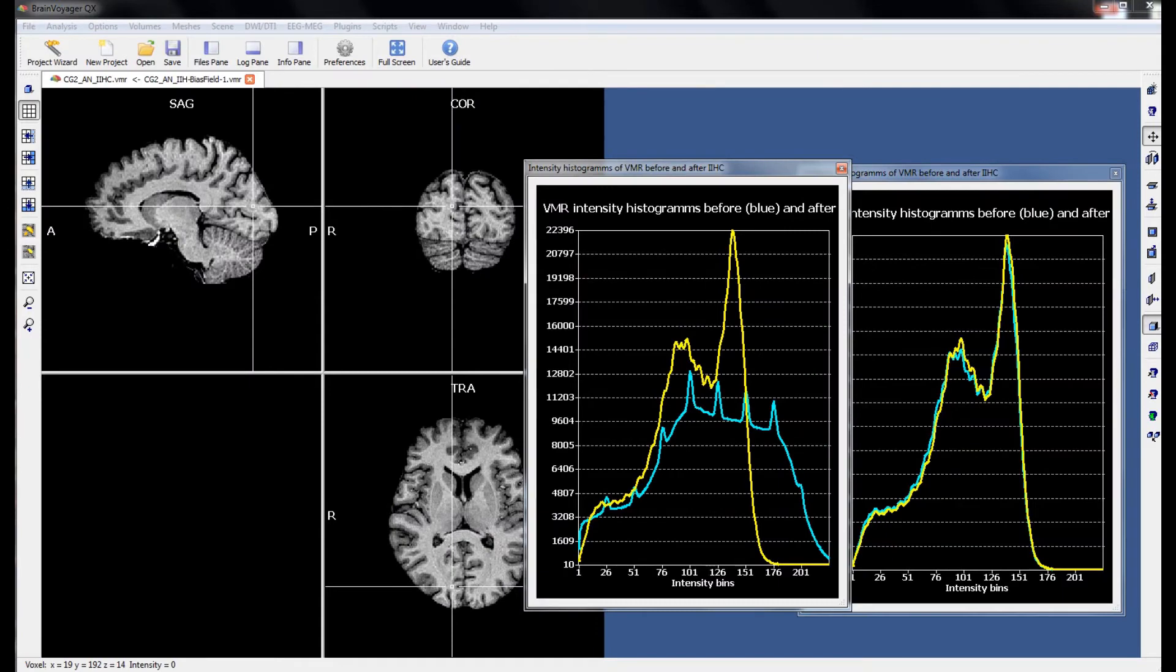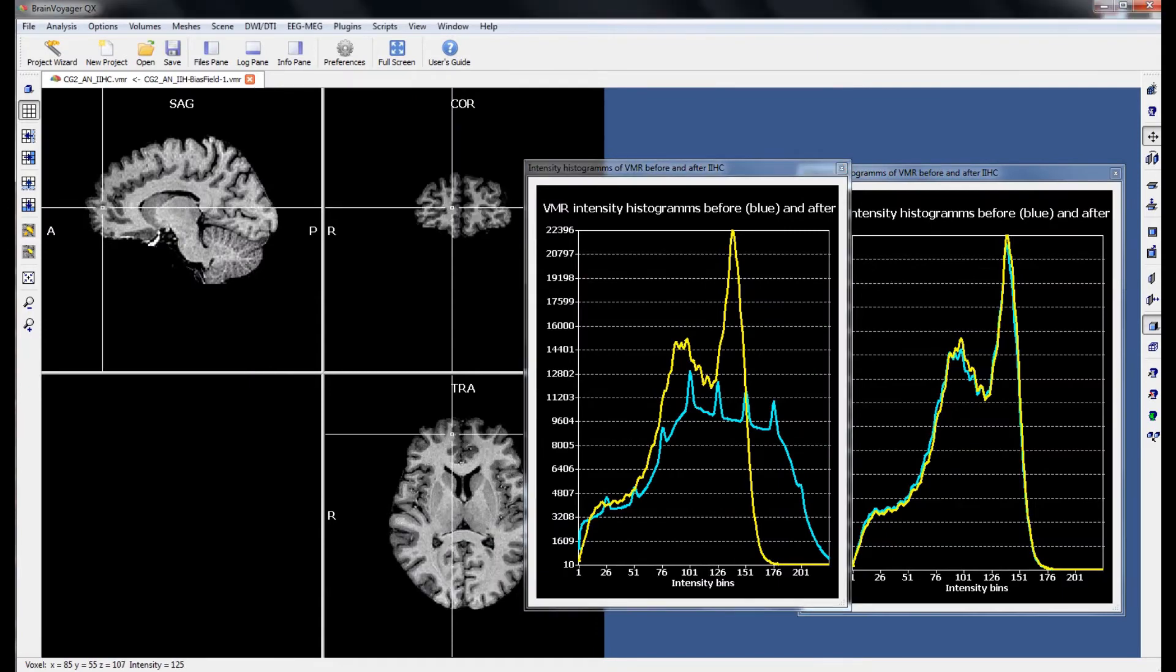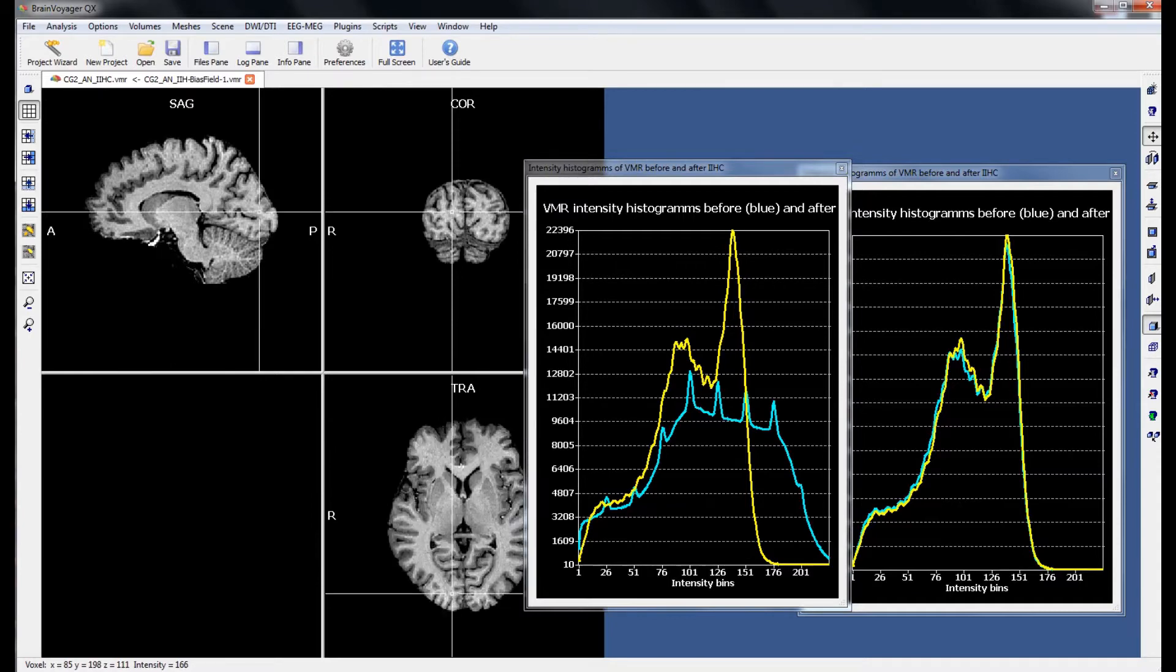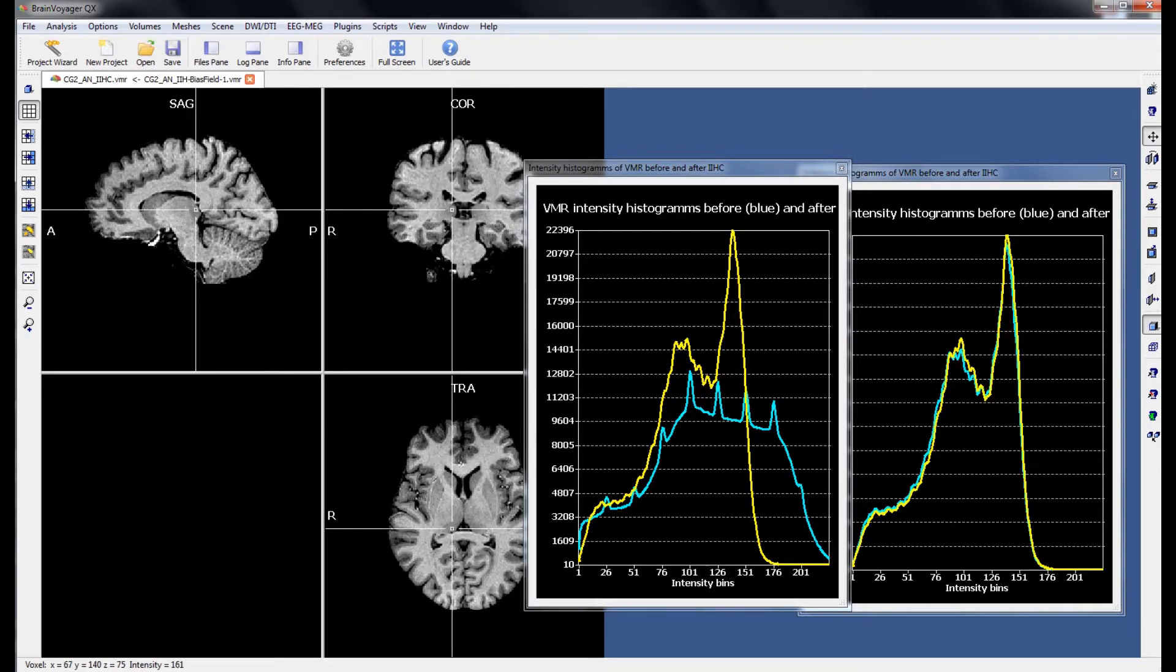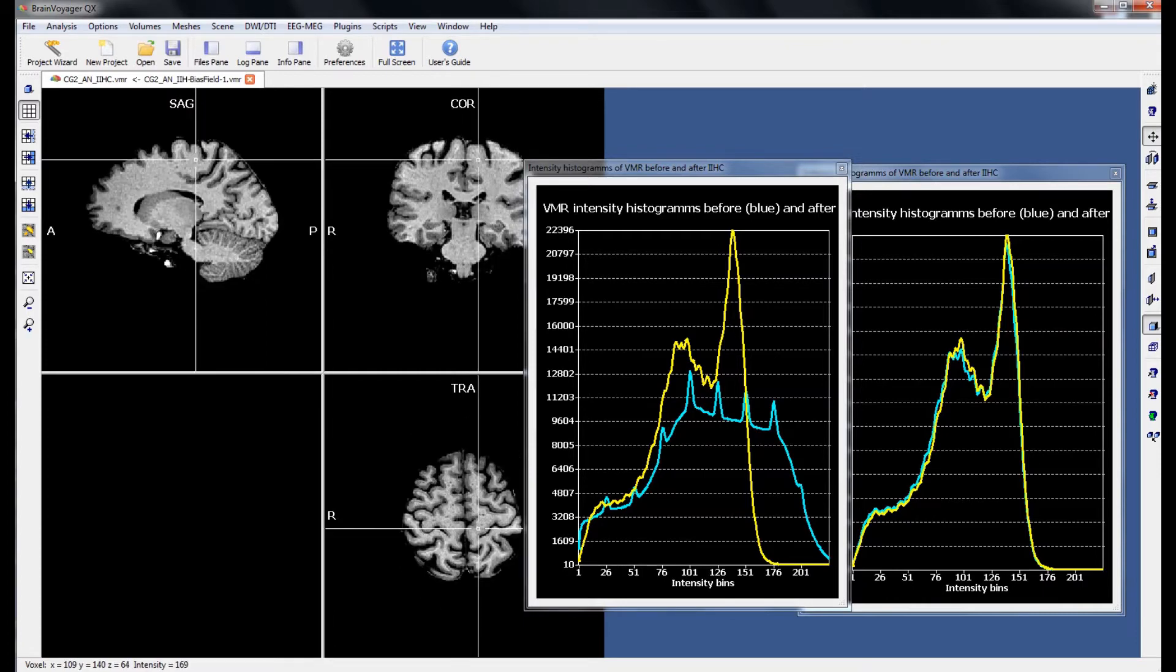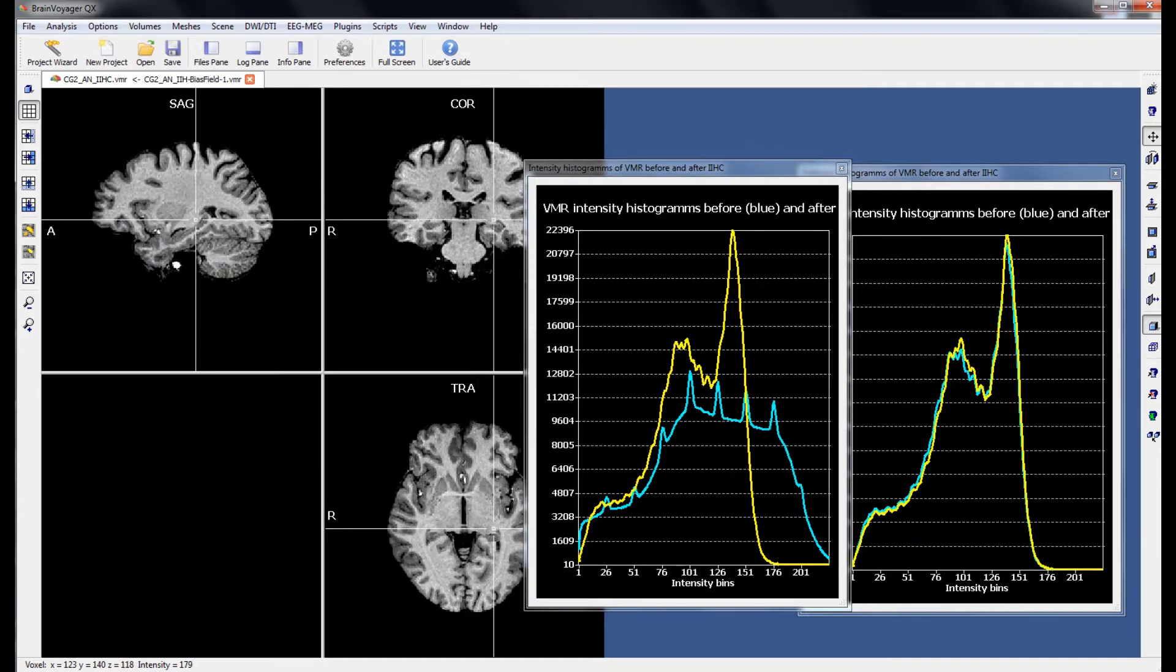You can see from a quick scroll through the brain that the range of intensity values that white matter take is more homogenous, as are the range of intensity values for grey matter. You can also see this represented on the histogram to the far right. There is a peak for the grey matter on the left, and a peak for the white matter on the right, and then a local minimum between the two which BrainVoyager can use to define what is grey matter and what is white matter.